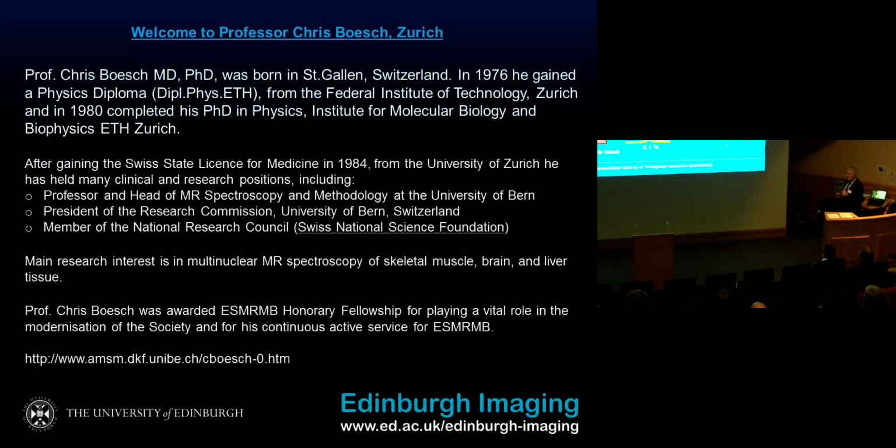So we really have to be very careful positioning our voxel so that we can study the IMCL, the dynamic part of the lipids, which are, as you see, also related to insulin resistance. We can look at EMCL, the distribution of EMCL, if we are mainly interested in the extramyocellular lipids, by specific spectral, spatial selective pulses or Dixon methods and so on. But on the other hand, we are also interested in IMCL, and that is not possible by these methods.